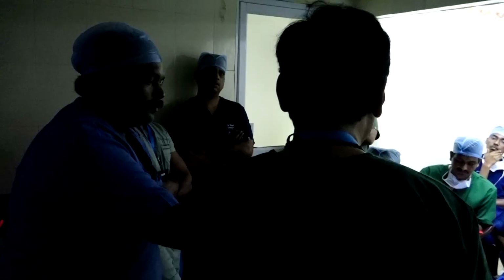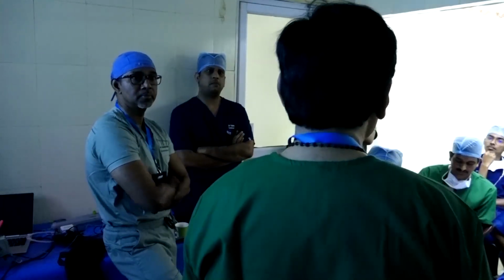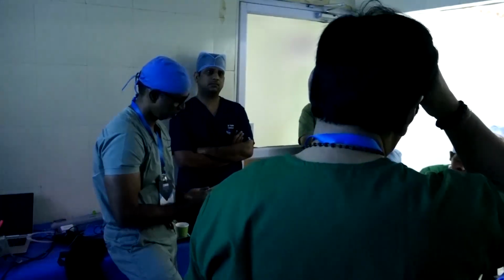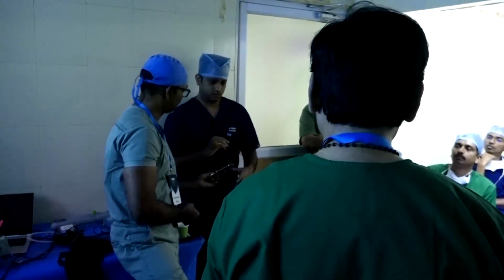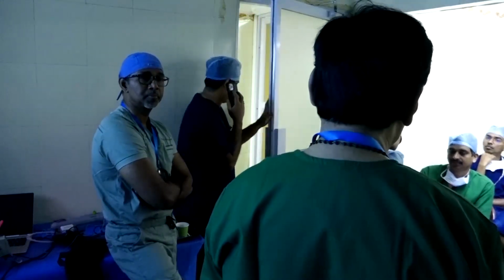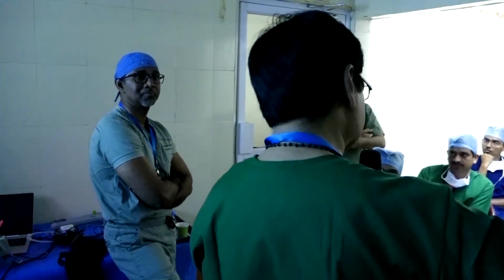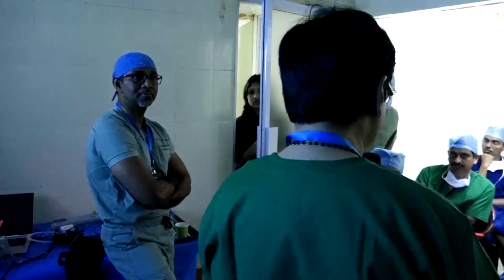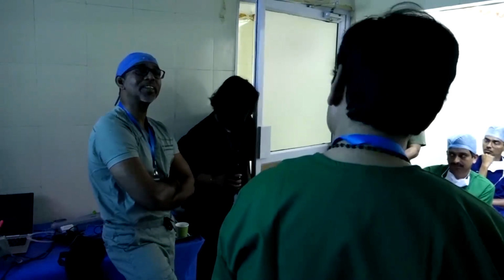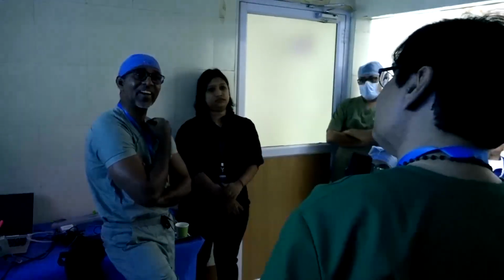Suppose your primary option is only IVL without ablation. Within 4 months the patient presents with angina, with the nodule again protruding into the stent. I have seen almost 5 cases, and it is very difficult to convince them for surgery. That's a disadvantage. If your primary option is IVL for a nodule, you get a very good acute result, but after 4 to 6 months the patient develops angina with the nodule coming back inside the stent. I have seen it, that's why I'm telling.